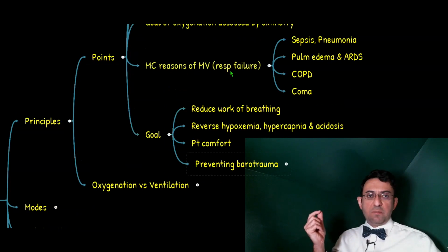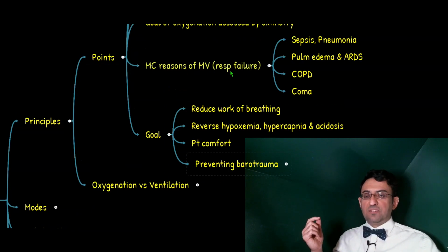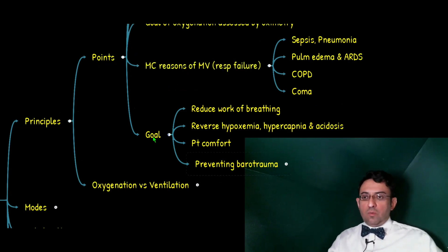Here we just briefly mention patients with respiratory failure, cardiogenic or non-cardiogenic pulmonary edema, COPD exacerbation, or any patient who is not capable of protecting the patency of his or her airway require active intervention. Active intervention does not necessarily mean invasive intervention. What are the goals of mechanical ventilation?